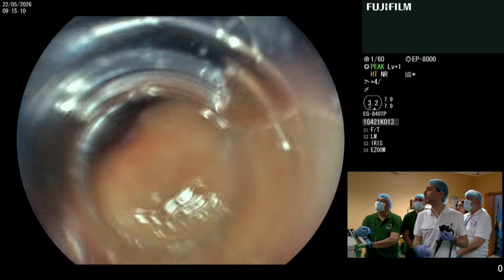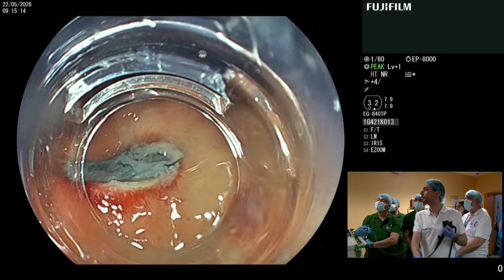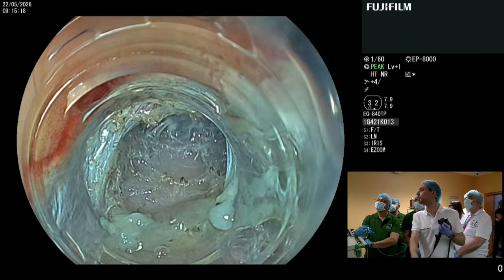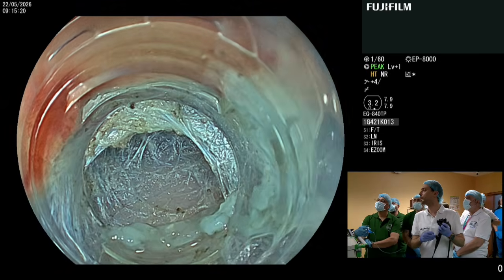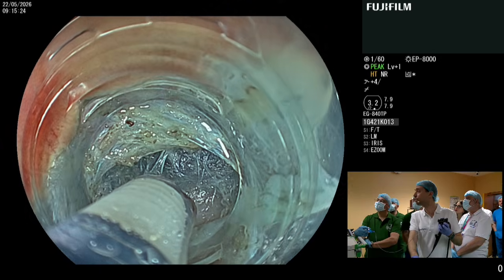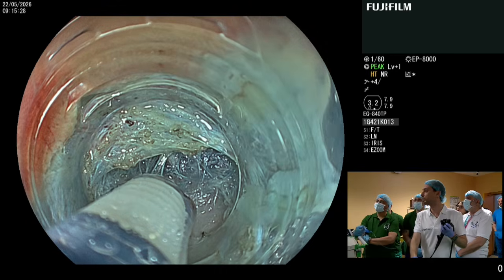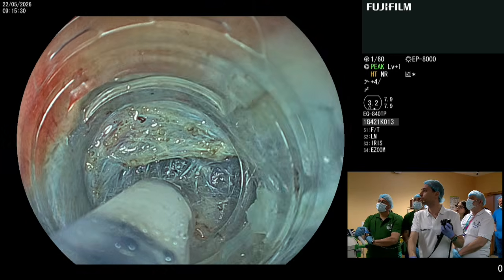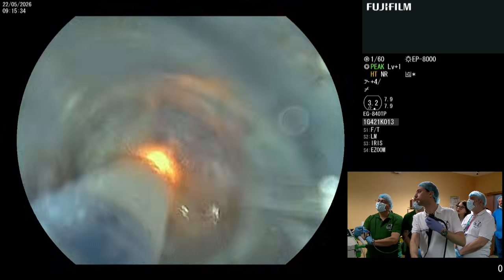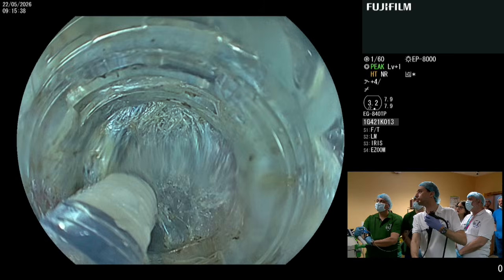We have from time to time to confirm that we have. Settings of your electrocautery. My electrocautery is endocut I2, effect 2, and the rest is 3-3 in duration and interval, but at this point I use forced coagulation for dissection, effect 4. If I encounter big vessels, I will switch to spray.